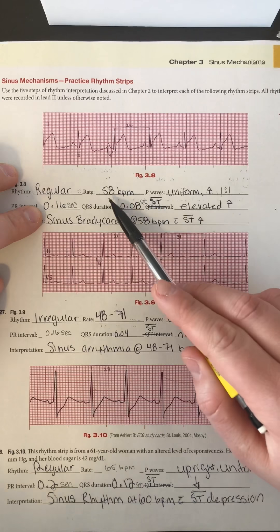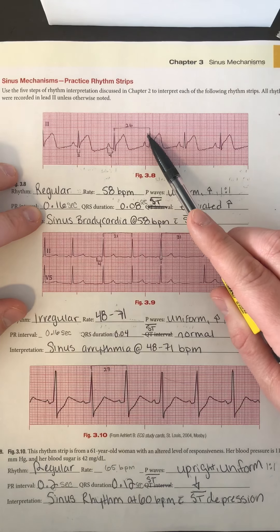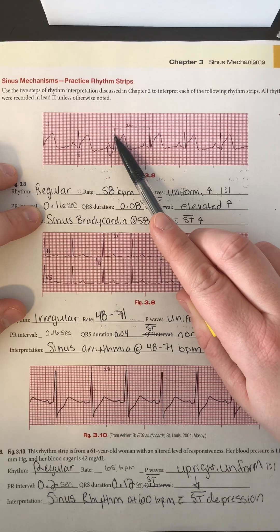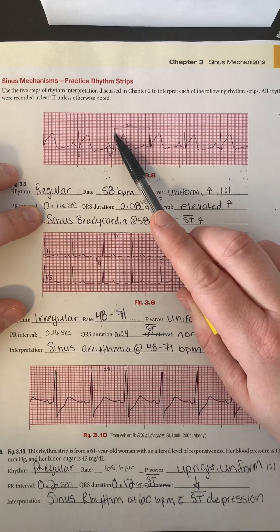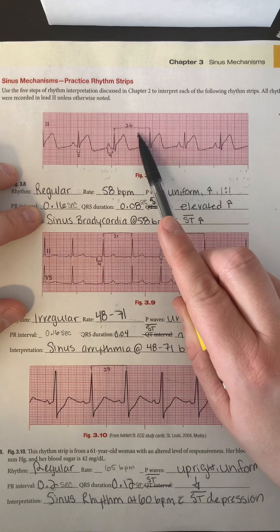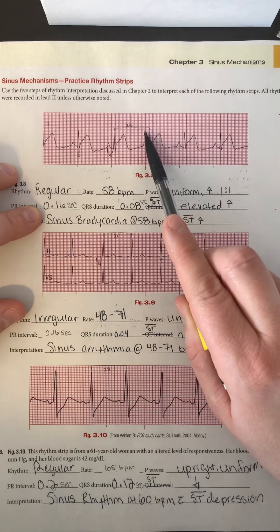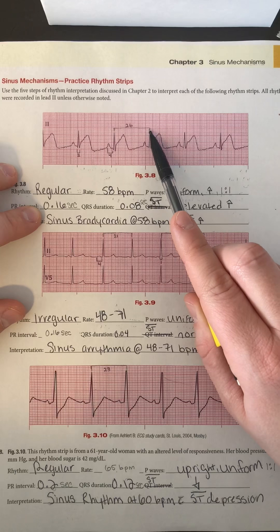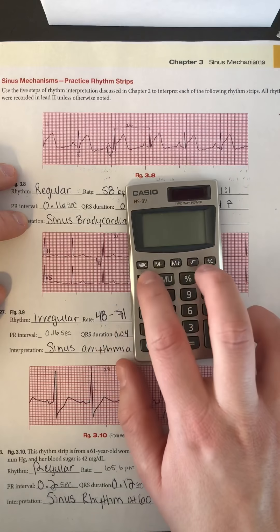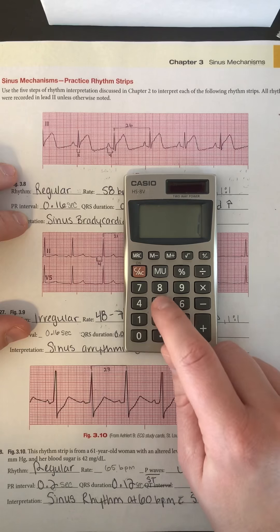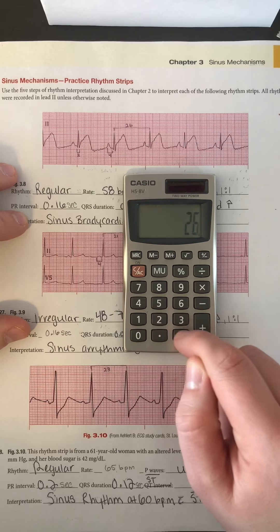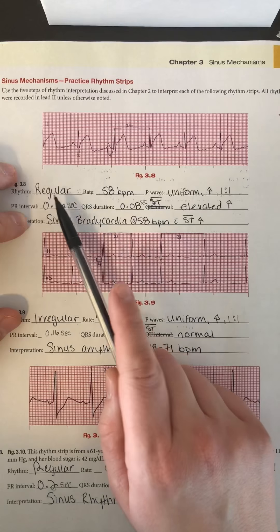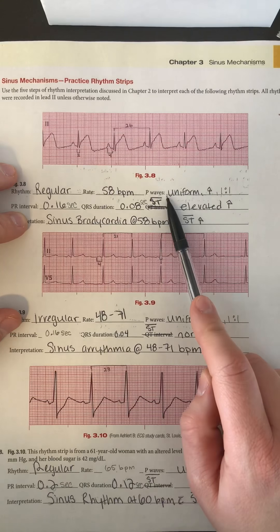To figure out rate, we're going to use the small block technique. I've sectioned off two QRS complexes that line up with the blocks pretty well so I don't have to split any blocks. I counted the number of small blocks: 5, 10, 15, 20, 21, 22, 23, 24, 25, 26. Using the 1500 method — 1500 divided by 26 — gives us 57.6, which I rounded to 58. So we have a regular rhythm at 58 beats per minute.